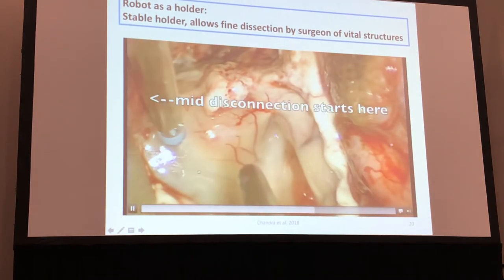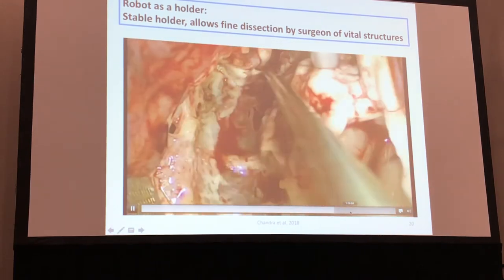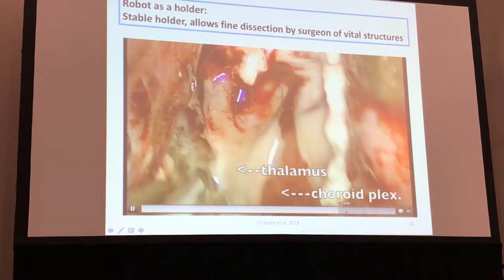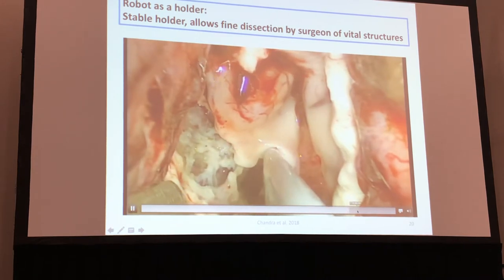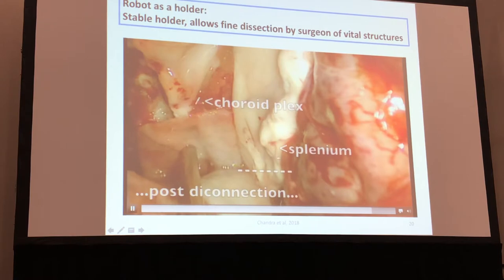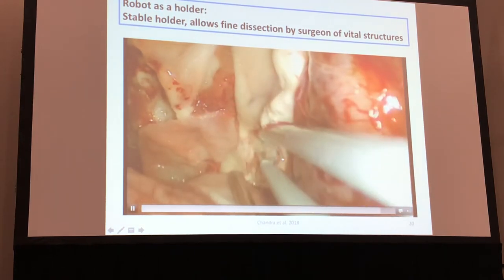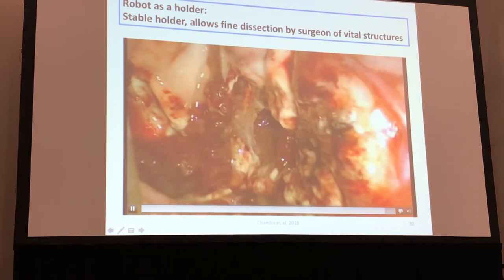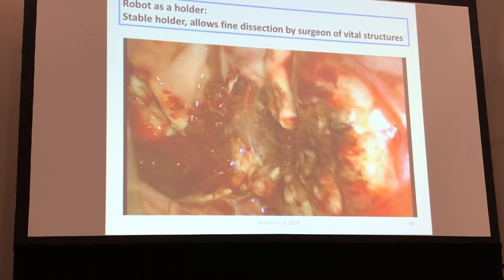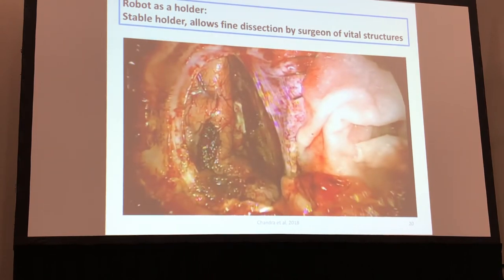And then we start with the middle disconnection, which is lateral to the caudate nucleus and then to the thalamus, and goes down vertically to join the temporal horn. And that's the end of the procedure. So you can see the visualization is really excellent, and the robotic holder provides an excellent stable feedback. So you can move it any number of times without your hands getting exhausted, and that's the scope coming out.